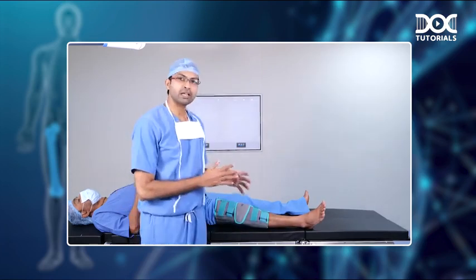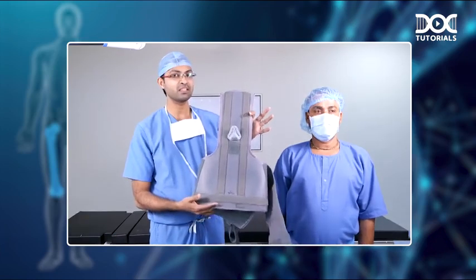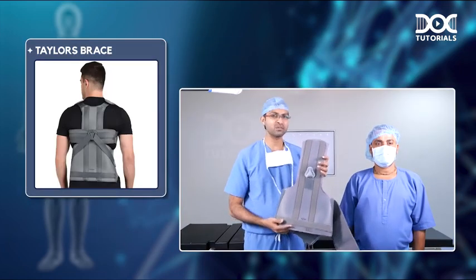Now this is how you apply a knee immobilizer. Now can you tell me what brace this is? This has been a spotter asked for your exam before. What is this? This is the Taylor's brace.